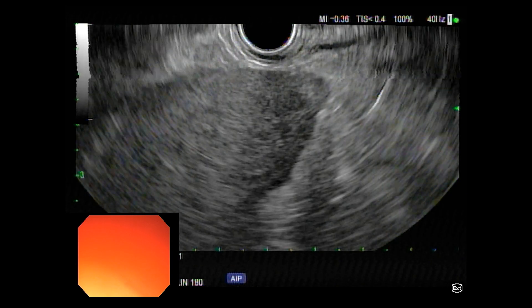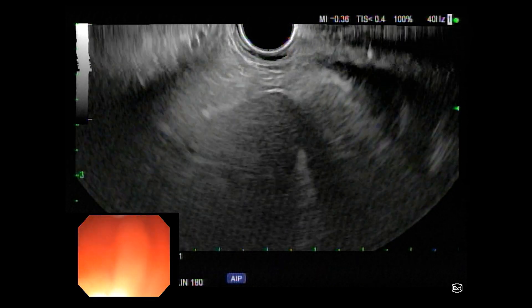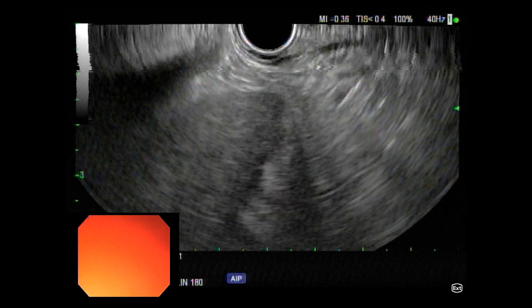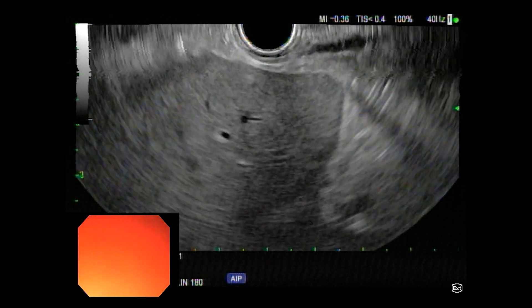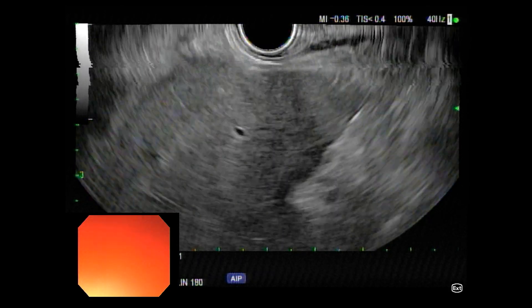I think we had a nice demonstration of post-liver-transplant biliary complications. The nice thing here is you don't see anything hyperechoic, which would suggest bleeding — that's the nice advantage of this ultrasound-guided technique as opposed to percutaneous.